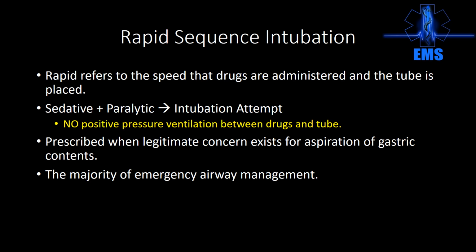That being said, the patient needs to be semi-stable before we try and do this. The patient needs to have reasonable blood pressure, reasonable heart rate, and reasonable oxygen saturation and end-tidal CO2 in order to prevent being rewarded with the post-intubation cardiac arrest. I think that if you follow the rules that I'm going to give you here, you're going to have a much better outcome, a much higher first pass success rate, and far less post-intubation cardiac arrest events than you would potentially have previously.